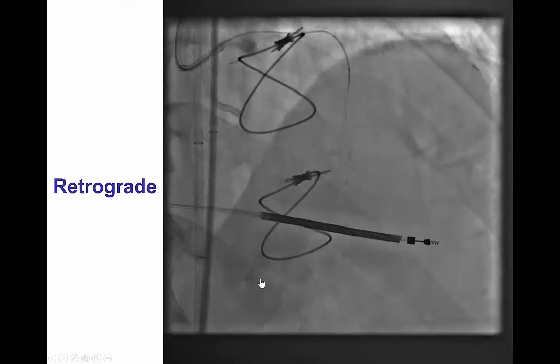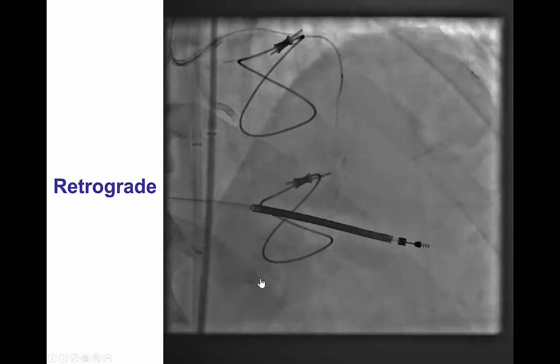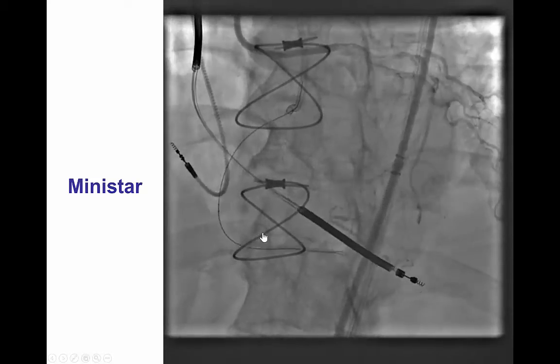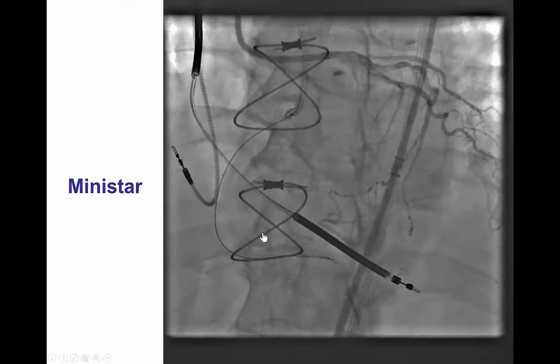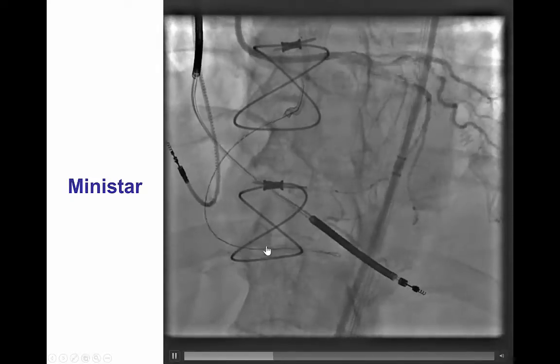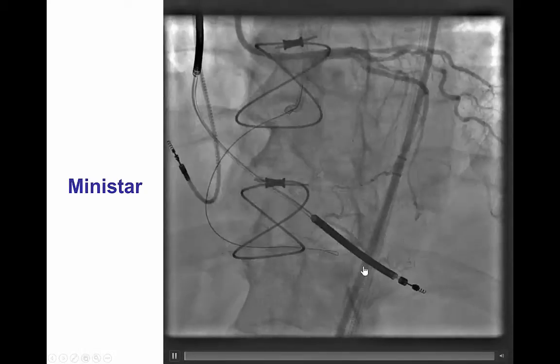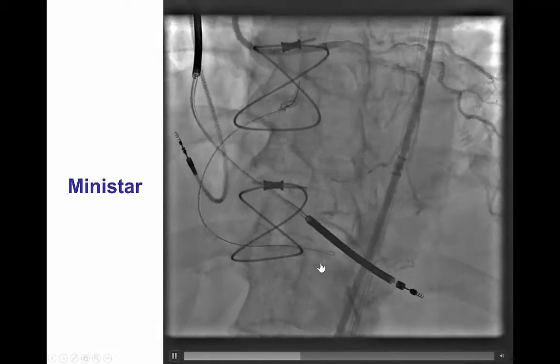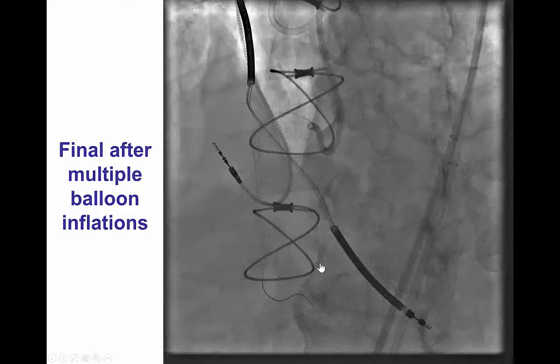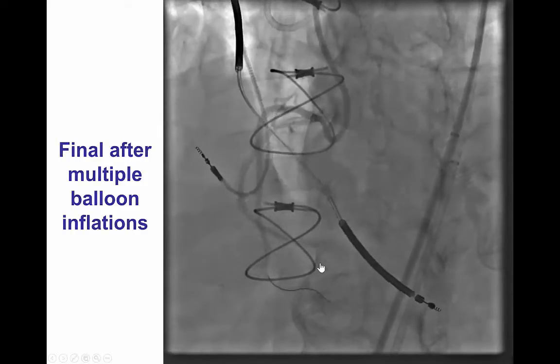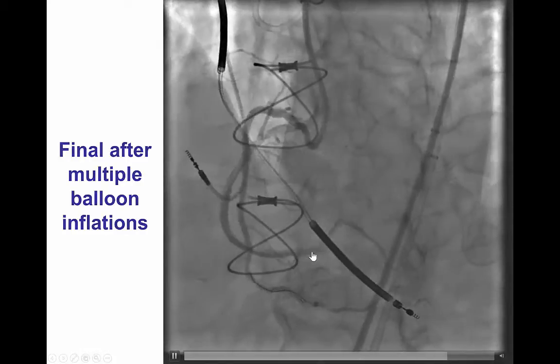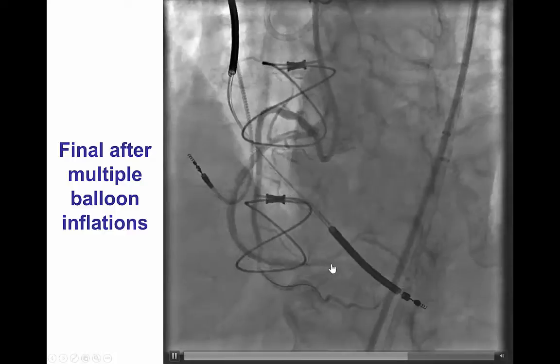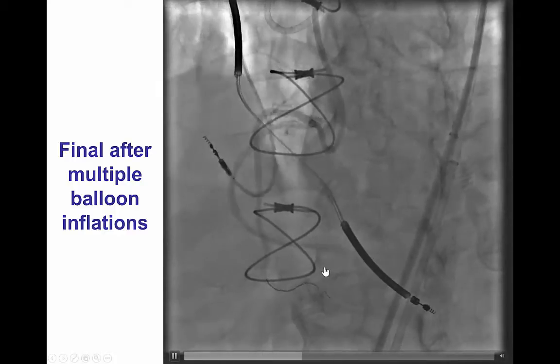We did a brief attempt for retrograde crossing through septal collaterals, but there was no connection. In the end, we performed the STAR technique, in which a Fielder XT wire was advanced with a loop at the tip all the way to the small posterior descending artery. This is an area to be extremely careful, because those small arteries can perforate. We did not put any stents, but instead performed balloon angioplasty, because we did not want to lose several of those branches, including the very large right posterolateral branch.